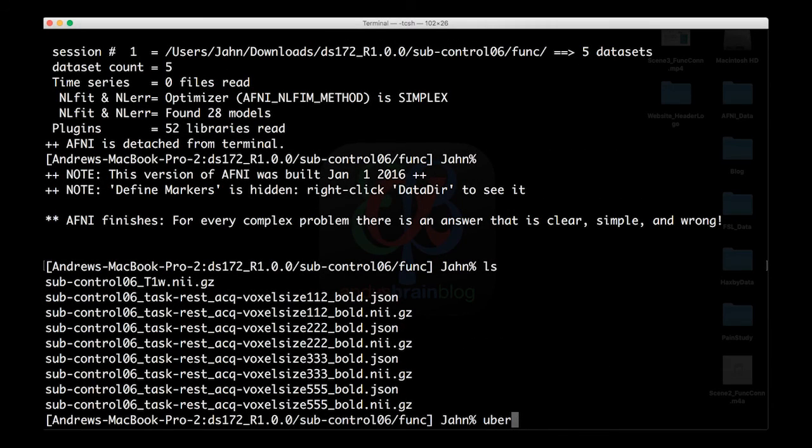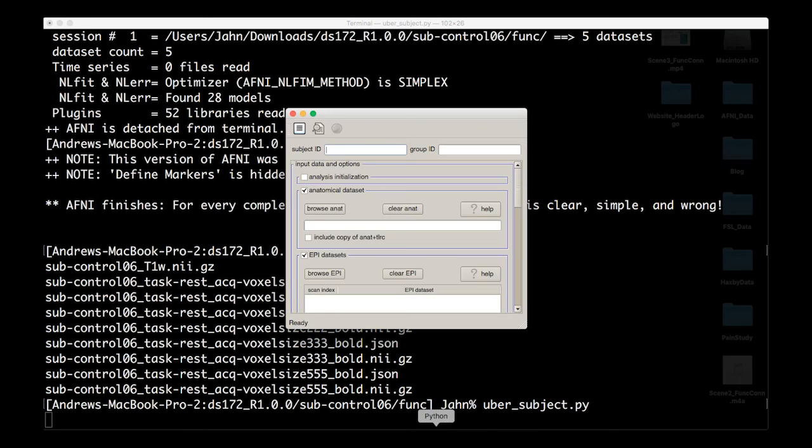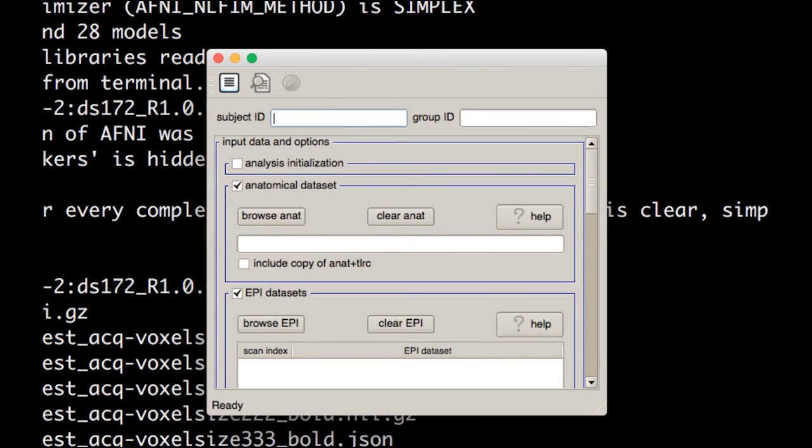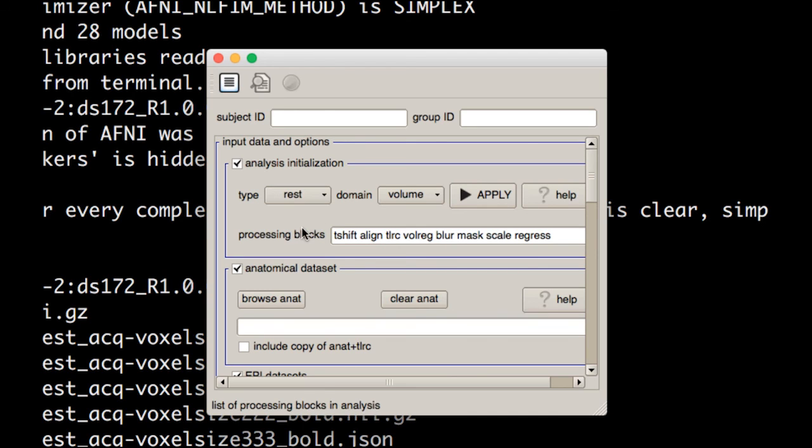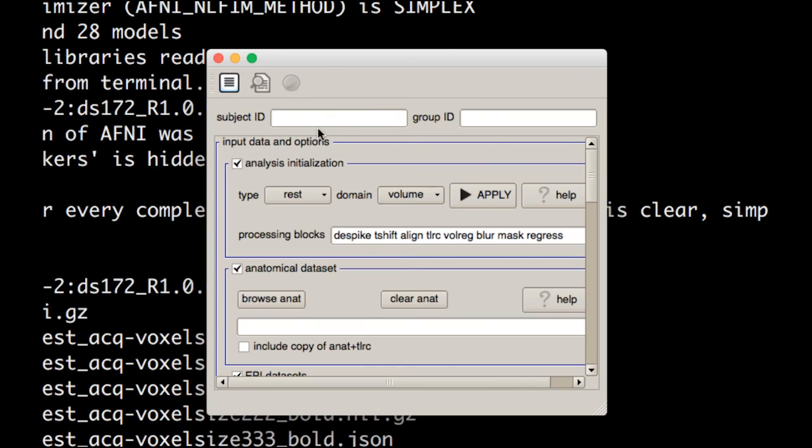The best way to do this is by using AFNI's uber_subject.py. Once this opens up, you'll notice that there are two ways we can initialize our analysis. There's task, which is the default, and then there's rest. Select rest and hit apply, and you'll notice that a few of the options change. These are just AFNI's defaults for doing a resting state analysis.